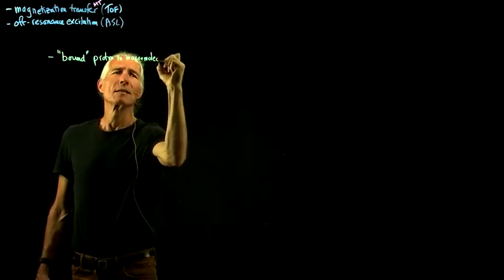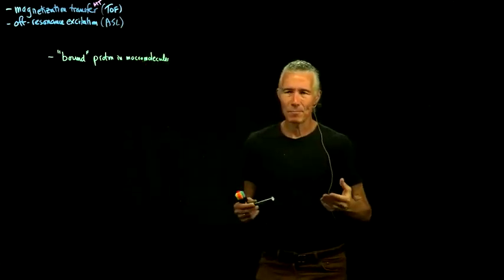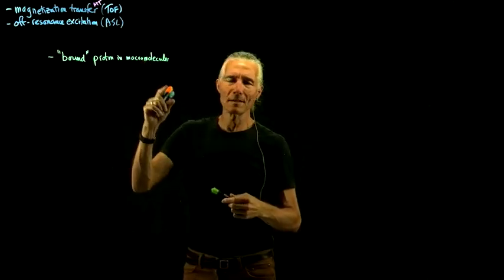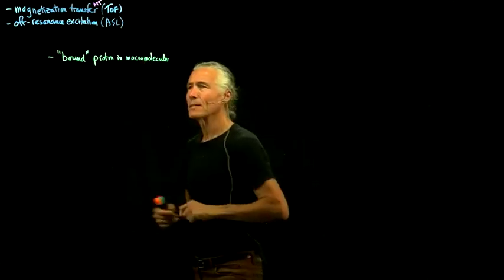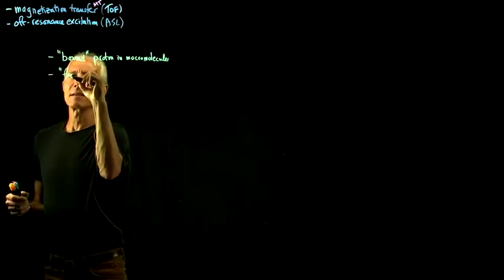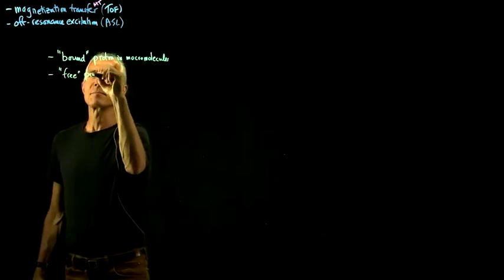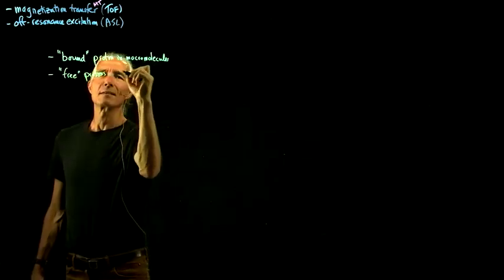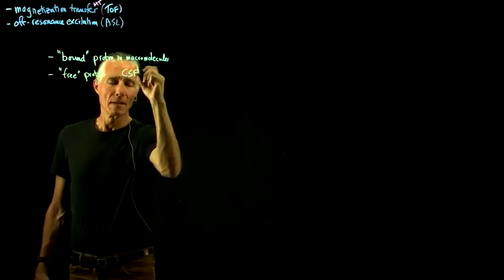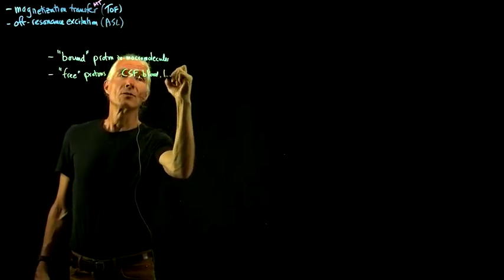So you have a lot of proteins and things like that that have protons in them, and those protons behave quite differently than another generic class of free protons, like free protons in CSF, cerebrospinal fluid, or blood or tissue fluids.